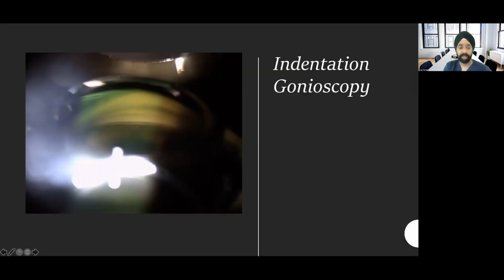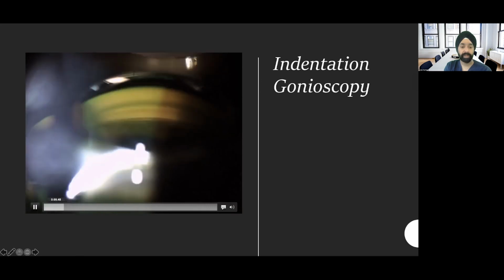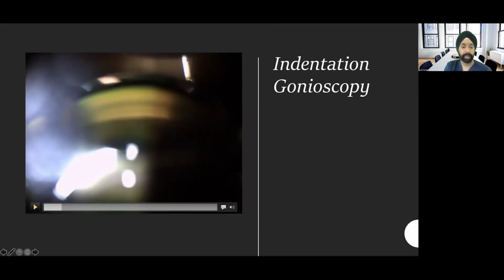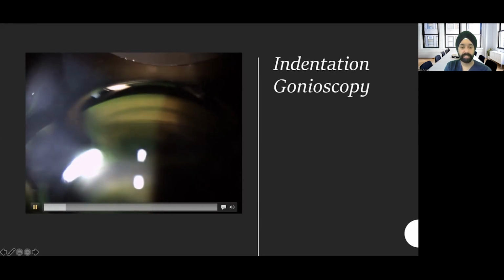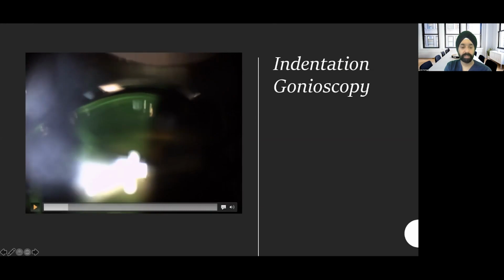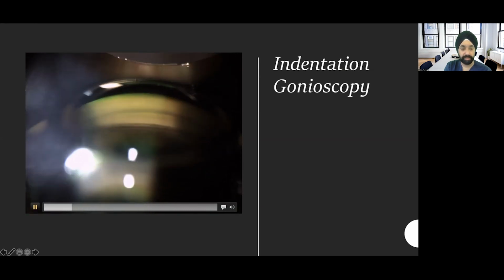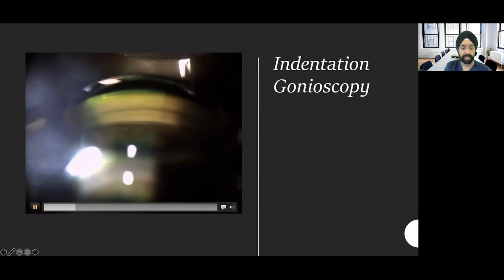I'm going to show you a video, one of my videos I just made. This is from last week, a patient I saw here. And what I'll show you is basically what happens when you have a narrow angle. So here's an angle where I'm actually going to show you. If I don't push, it's hard to see. When I push, you can see there's depth, I let go, and it's hard to see angle structures here. Let me see if I can show you there. So I deepen, push there, I relax. So relax and I deepen. And there you go. See, I deepen.